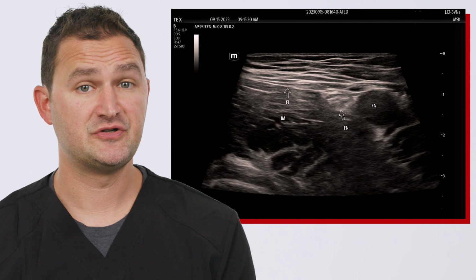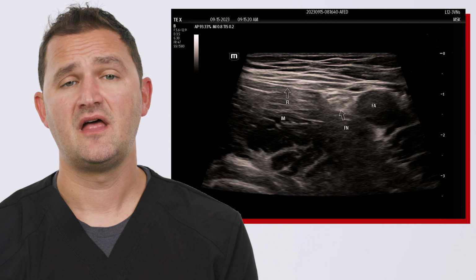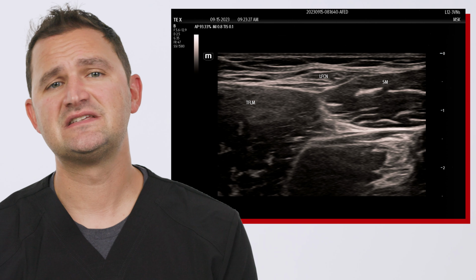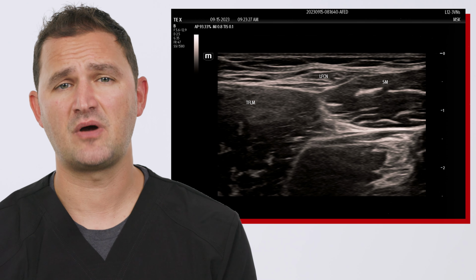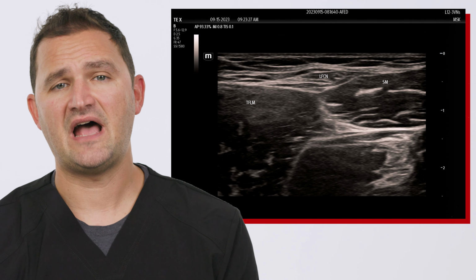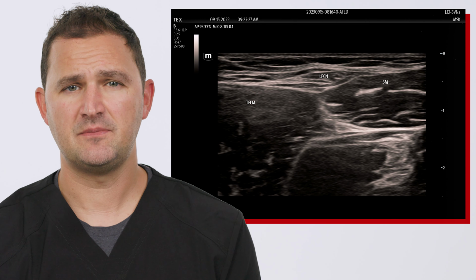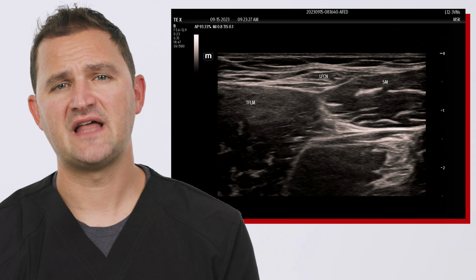To block the lateral femorocutaneous nerve, I'll start at home base with a femoral nerve block, identifying the femoral artery, lateral to that, the femoral nerve, and then the iliacus muscle. Scanning more lateral, I'll find the sartorius. Again, it is important to make sure that you're caudal to the ASIS so that we can properly identify the sartorius. Going further lateral to the lateral aspect of the sartorius, you will see the tensor fasciae lata muscle meet up with the sartorius. Just above the lateral lip of the sartorius is where you'll generally find the lateral femorocutaneous nerve.